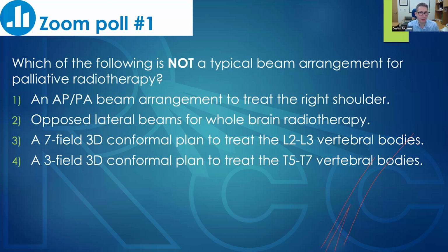So which of the following is not a typical beam arrangement for palliative radiotherapy? And I'll set a 1-minute timer starting now. I see lots of people dropping answers in the chat. That's great. Everyone is choosing 3.